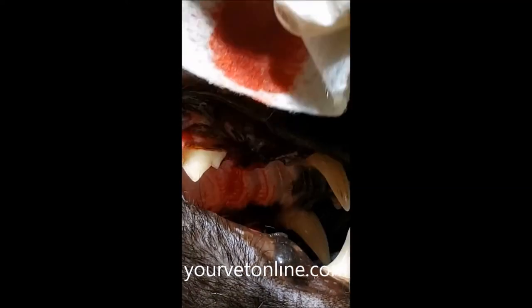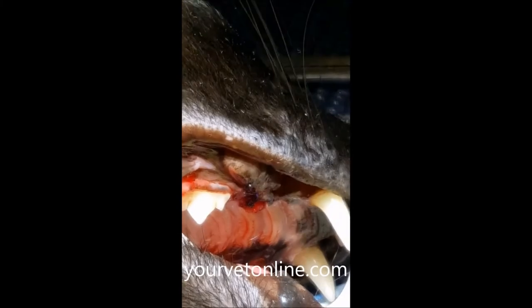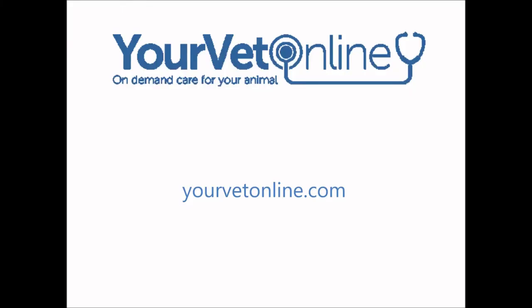Not all situations, of course, need tooth removal. Sometimes we might choose to do a root canal therapy or some other sort of orthodontic treatment. Here we can see the two tooth roots of the tooth that was removed.